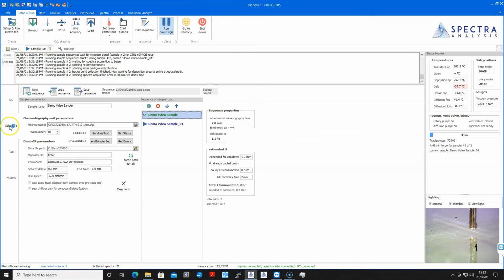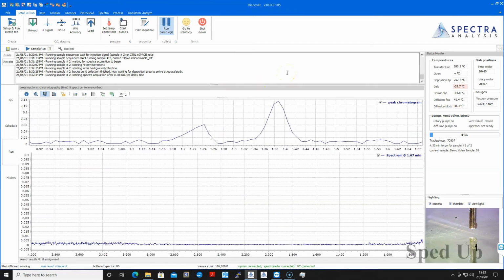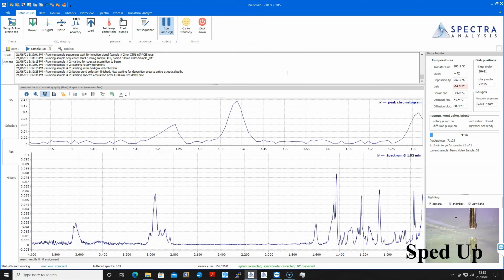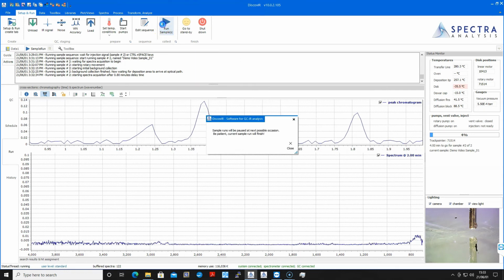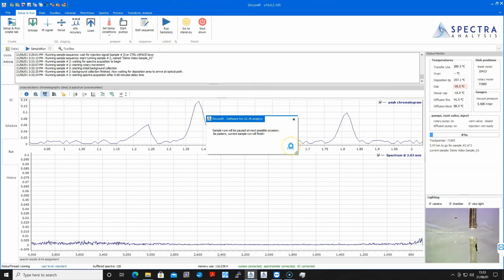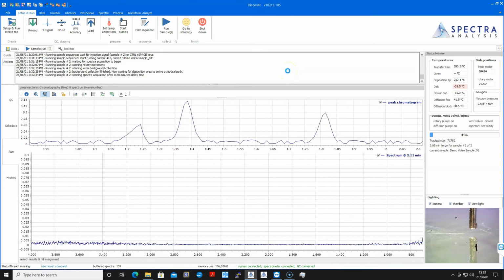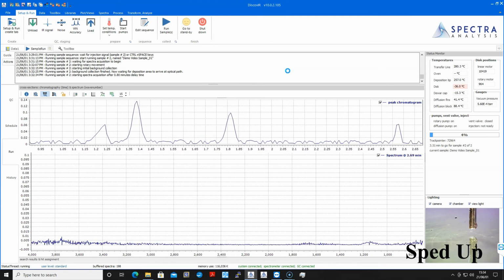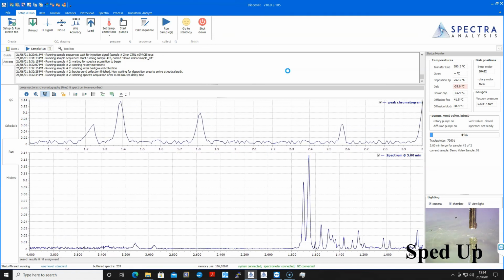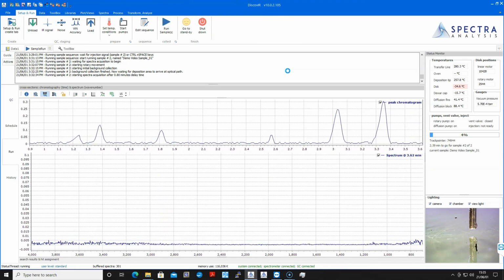Unrun samples in the schedule sequence list can be reordered and edited while running. The Pause Sample button may be pressed and the Discover will finish the sample it is on and wait for further instructions. The Discover will automatically move to standby mode when the sequence is completed. If the operator would like to override this, they can use the expansion arrow under Collect and uncheck it.